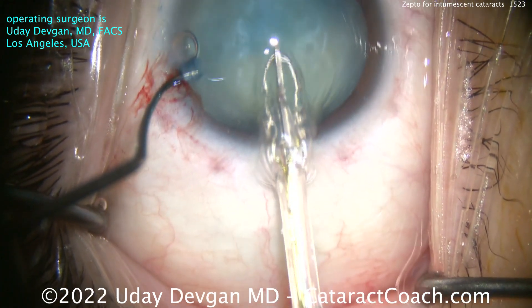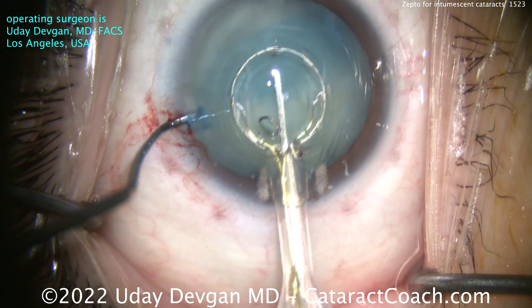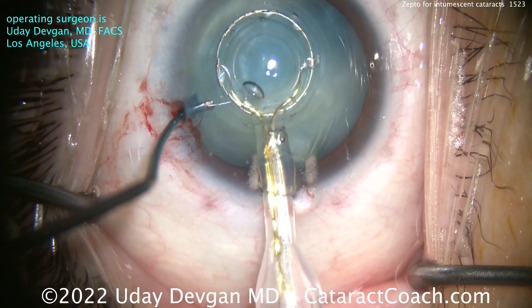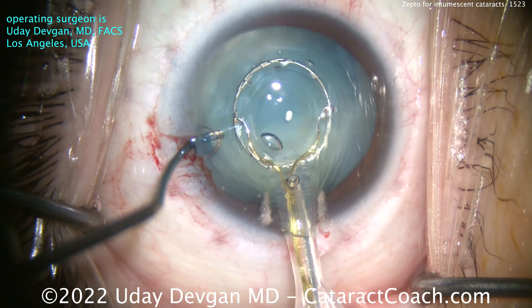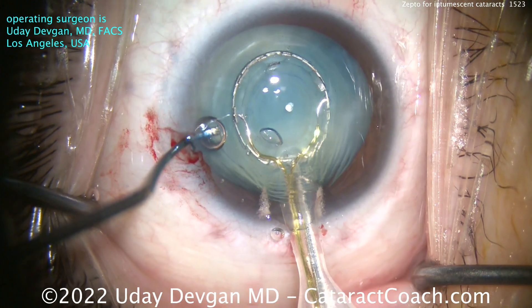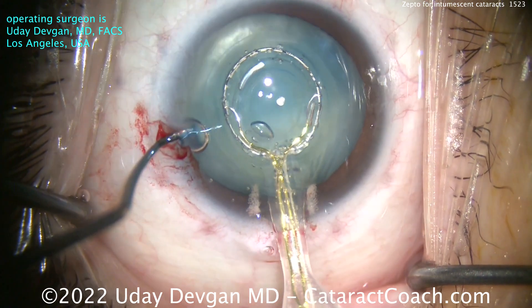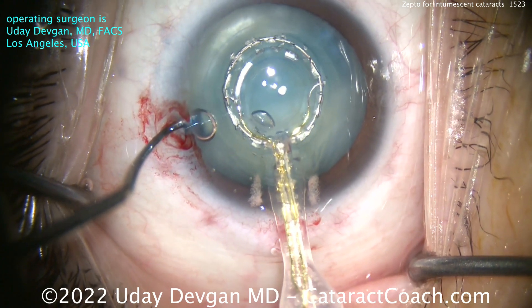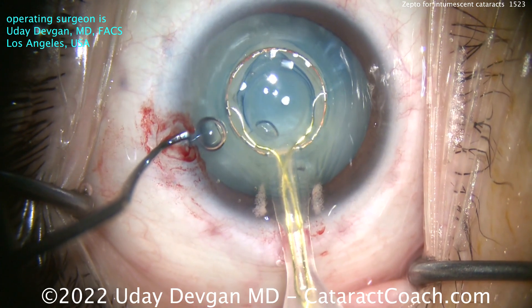Place it inside the eye, then re-expand it to the normal round size, and center up that ring wherever you want the rhexis. Looking at that ring, center it up — look at the Purkinje images, that looks great. We turn on some suction, and as the suction is on, we fixate and hold that capsule in place. Then a little brief burst of electricity goes through there.